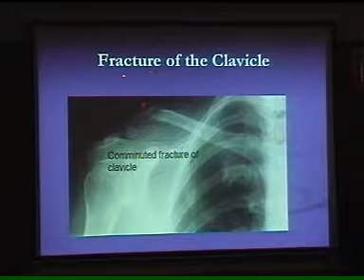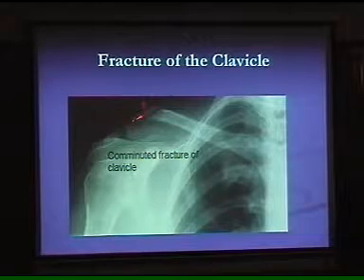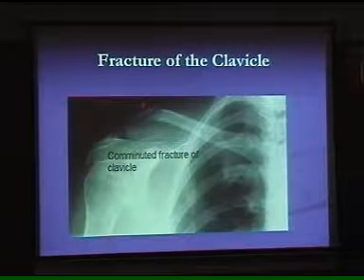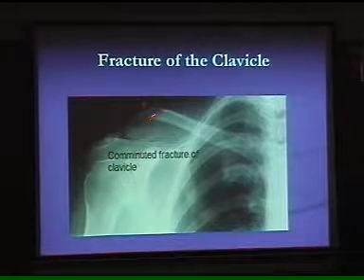Now just to show you a couple of fractures over here, fracture of the clavicle. If you look at this laterally, there's a fracture line over here, the lucent line over there. Sometimes these things are seen in the form of metastatic disease as well. History of the patient is very, very important. With a young man coming with history of trauma, cricket playing or boxing, anything, that's okay.